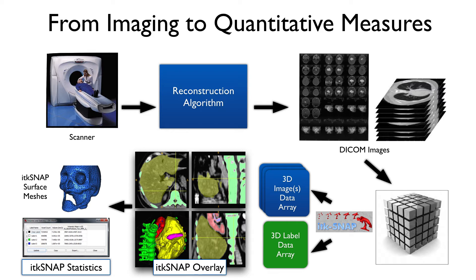ITK-SNAP represents the image in memory and also a corresponding 3D label data array. For every voxel in the 3D volume, ITK-SNAP assigns it an anatomical label. The task of segmentation is assigning labels to voxels using various tools. You can see an example of a 3D image with overlaid segmentation where different anatomical labels are painted with different colors. Once complete, you can measure volumes and statistics of different structures, and also export three-dimensional meshes for 3D printing.